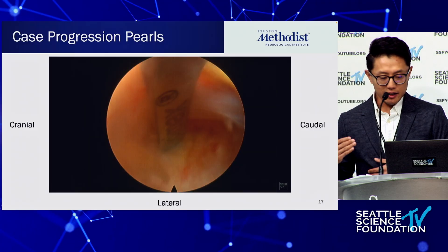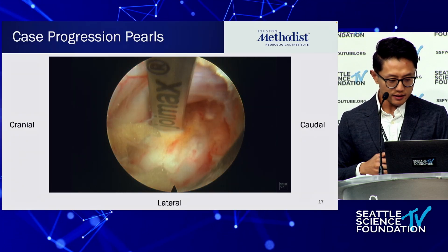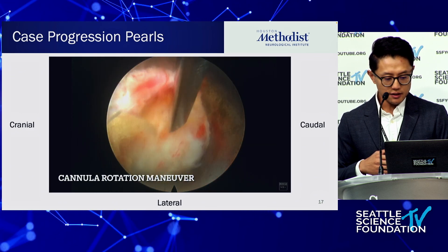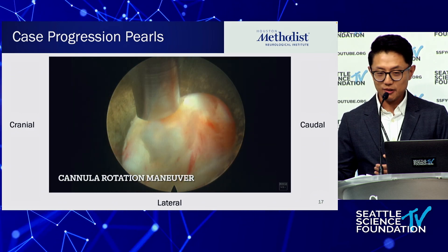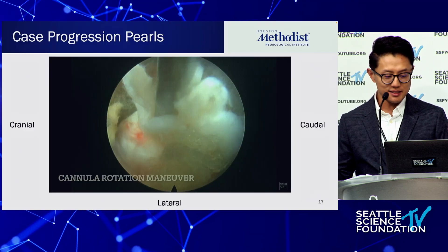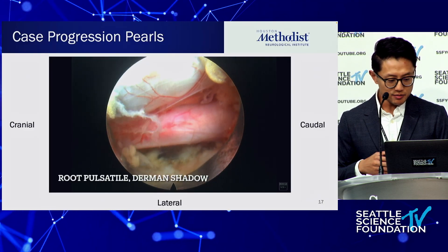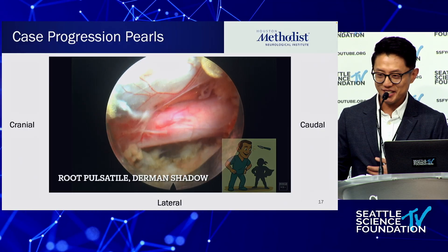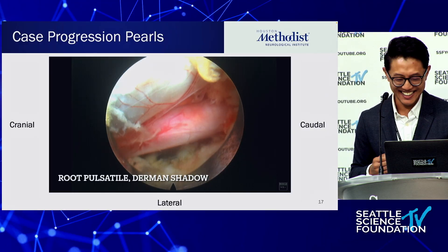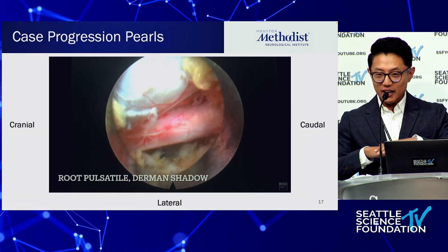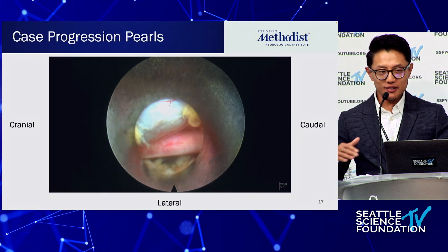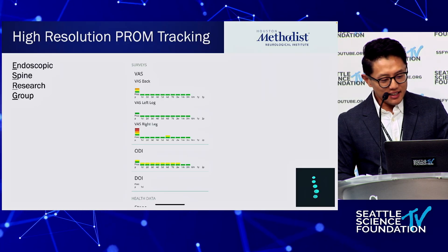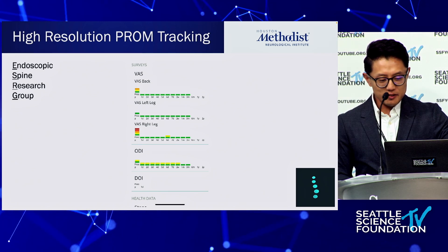Use a blunt ball-tip dissector probe to release those epidural ligaments. Once released, you can perform the cannula rotation maneuver. Leave your dissector there and start to manipulate the cannula — sometimes rotate counterclockwise, sometimes clockwise, whichever way the root wants to move. Once you've got the root decompressed, you'll see the Derman shadow — as Peter described — a shadow underneath the nerve root that's pulsating. That's how you know you're done.